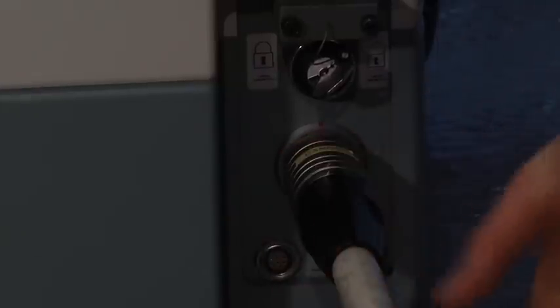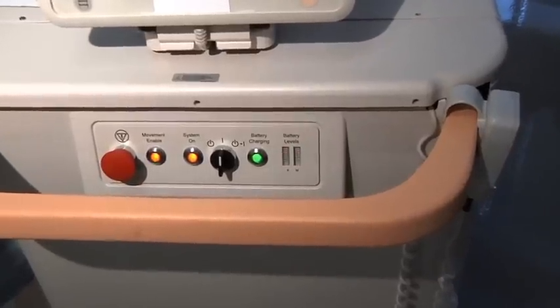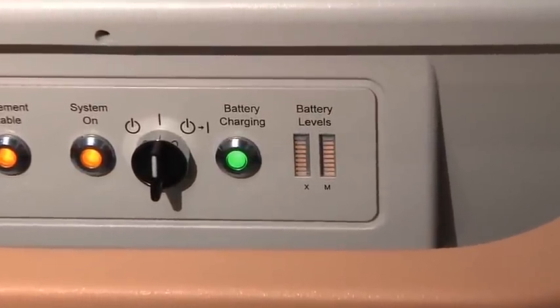Give it a tug to make sure the connection is secure. You'll know the system is properly connected if the battery indicators on the OARM IAS power panel are scrolling.